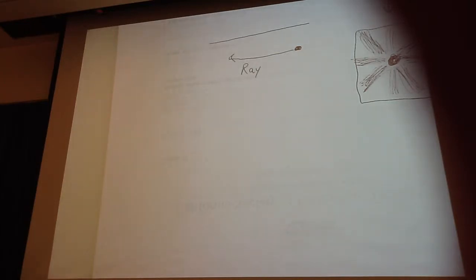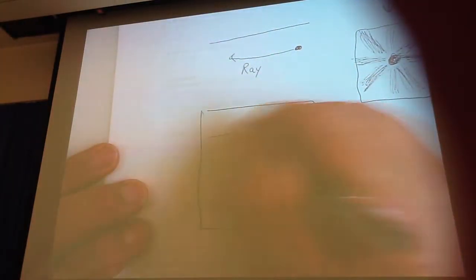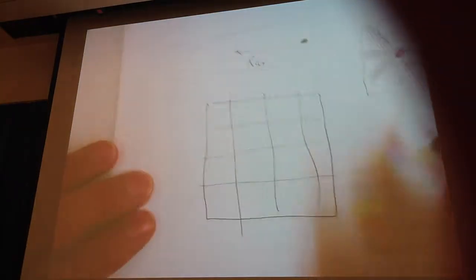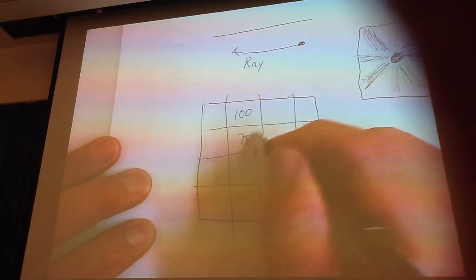Yeah, the order tells you, in other words, let's say that we have an image here. We know that on an image there's going to be all different numbers in each one of these pixels, right?